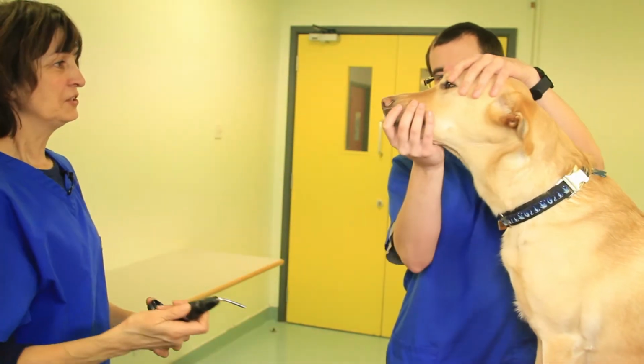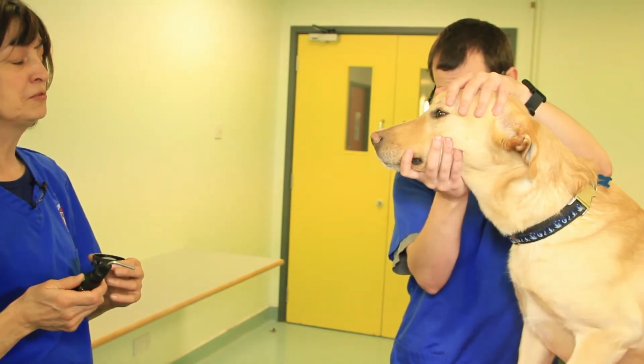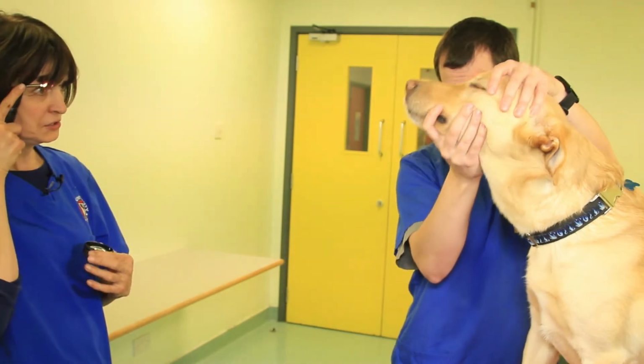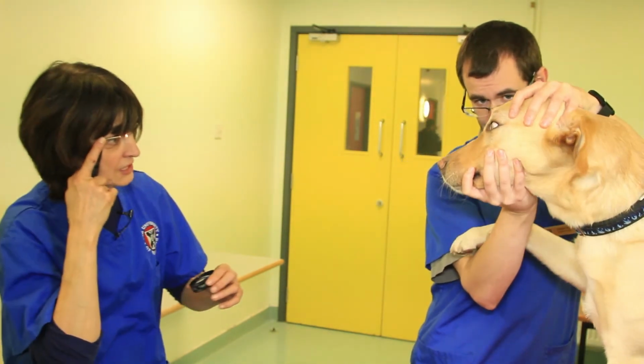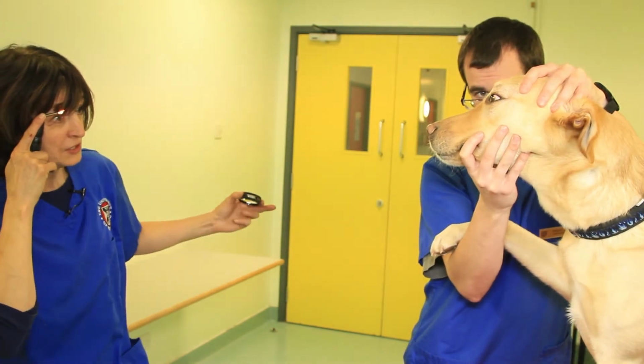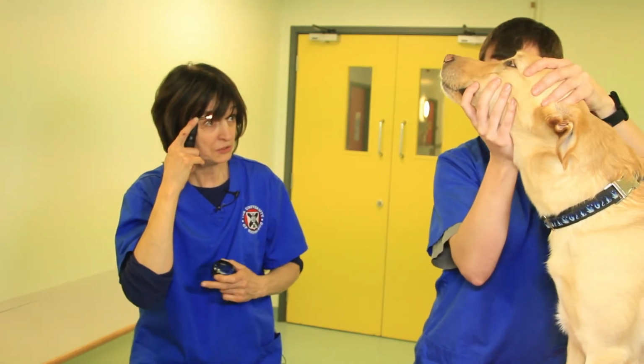So we've got our patient looking at us. I'm relying on my assistant to hold the lids open for me and hold the dog's head straight. And then I bring the light source to my temple and I move until I see the tapetal reflex. And he's looking down towards the floor now, so I would have to go in that direction to line up with his pupil and see his tapetal reflex.